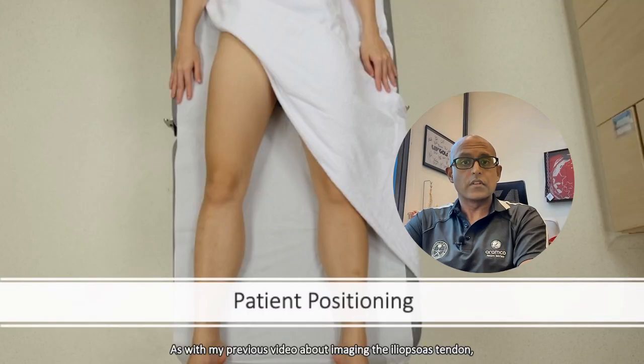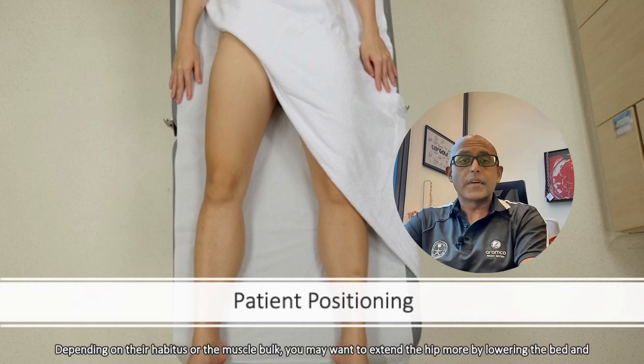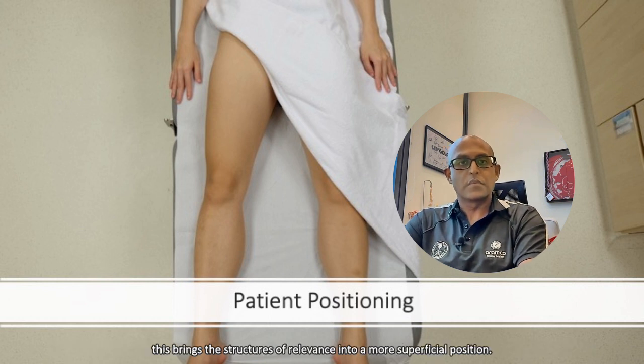As with my previous video about imaging the iliopsoas tendon, I tend to have the patient lying in a supine position with the hip exposed and their dignity preserved with a towel. Depending on the habitus or the muscle bulk, you may want to extend the hip more by lowering the bed, and this brings the structures of relevance into a more superficial position.